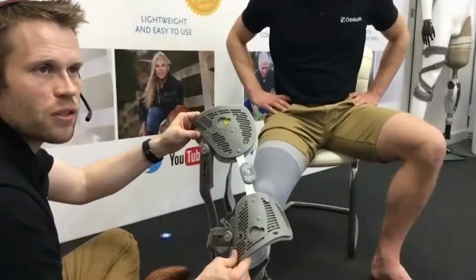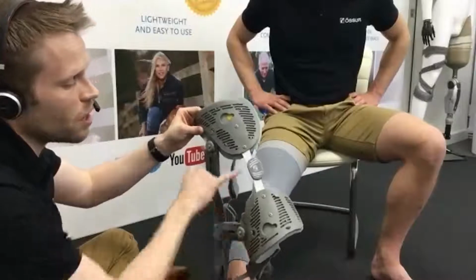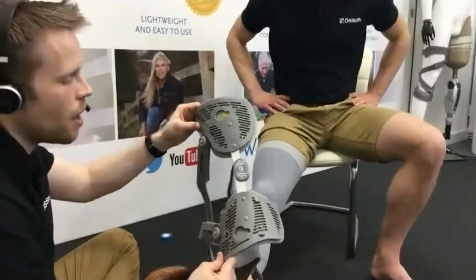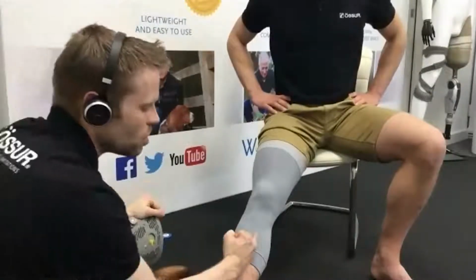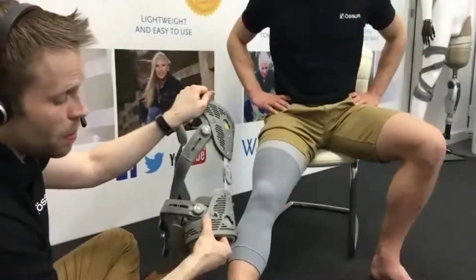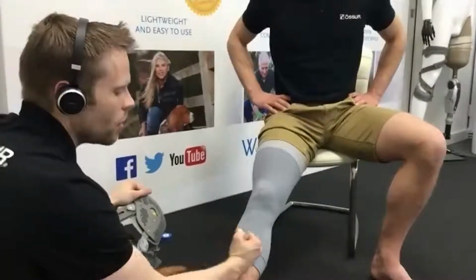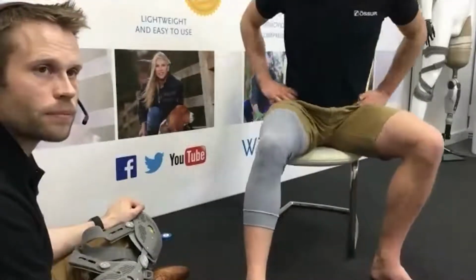And if in those situations you need to do that, just contact us and we can send you an extra stop that allows a degree of hyperextension and just allows it to conform to that shape. One of the other things you can also do is apply a small piece of padding built in between, just add padding in between the frame and the liner and just pad either side of the tibia. So that gives you an option to offload that area.